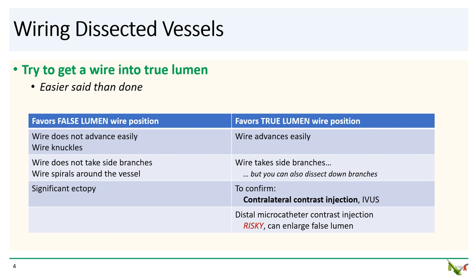Now, if your wire advances easily and takes all of the side branches, then you are probably in the true lumen. However, remember you can also dissect down side branches. So just because you're going down side branches, it is not a slam dunk. The wire needs to go freely and easily down the side branches.